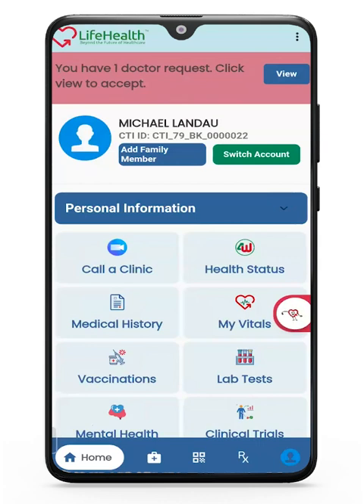So I hope you see the value of this. This is a product that can be used by the patients in their home. It can be used by home health workers, and it can be used by doctors in remote locations, or it can be used by a doctor when a patient's making a visit, even though they may have an otoscope and a stethoscope. But by being able to use this to have a recording of it, it's going to make patient care fundamentally and exponentially better.